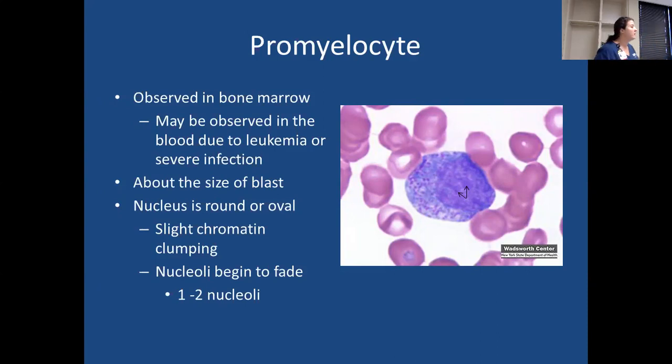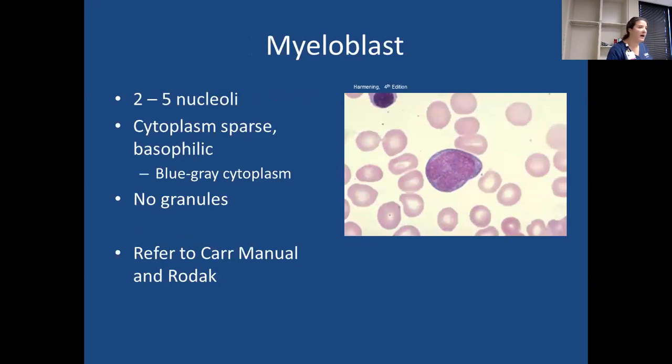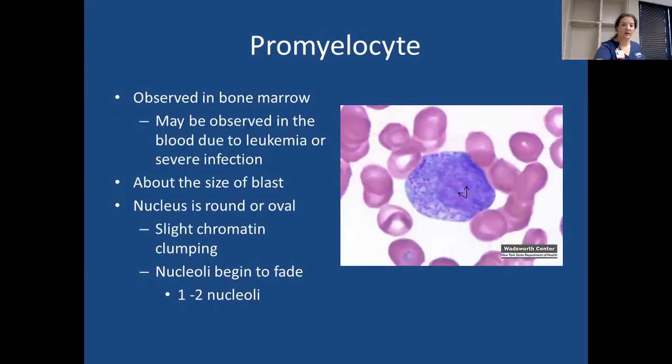And you should see the number of nucleoli start to decrease as well. Sometimes it's very hard to tell with nucleoli, though. Is that what the arrows are? The arrows are actually pointing to your nucleoli, yes. Depending on how they take up the stain, they can appear as these clear areas right here. So that's the nucleoli. Or they might even appear as slightly darker areas. It just depends on how the cell landed on the slide and how they take up the stain.